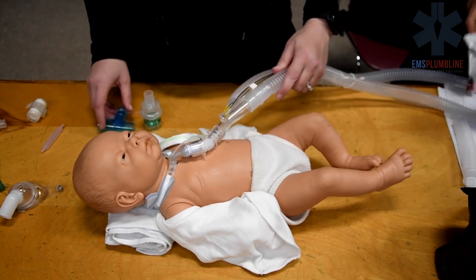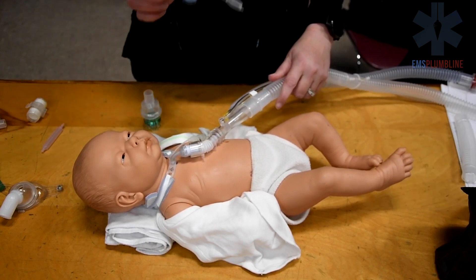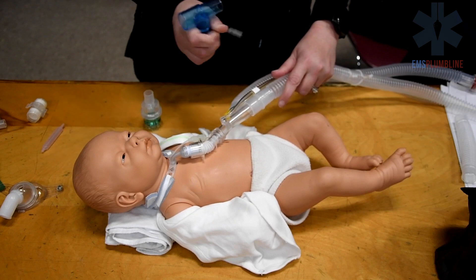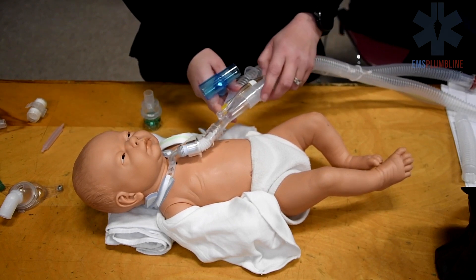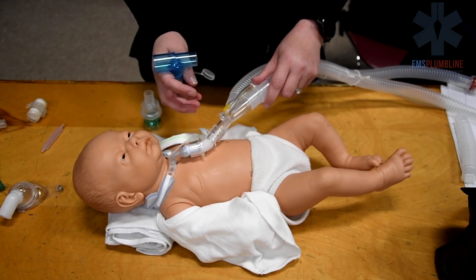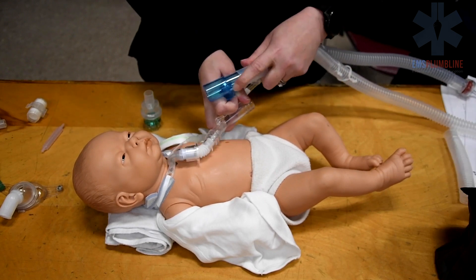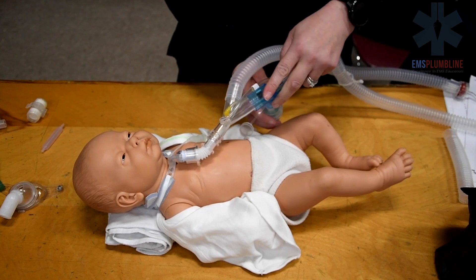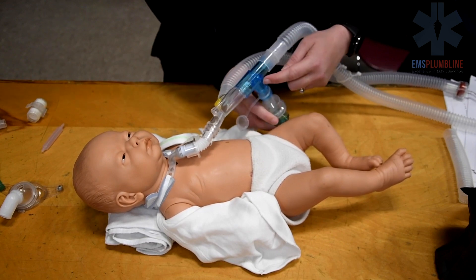A nebulizer can also be administered via the ventilator. Attach the nebulizer cup to a T-piece. This needs to be on the inhalation side of the ventilator circuit. Connect the oxygen tubing to the end of the nebulizer cup.